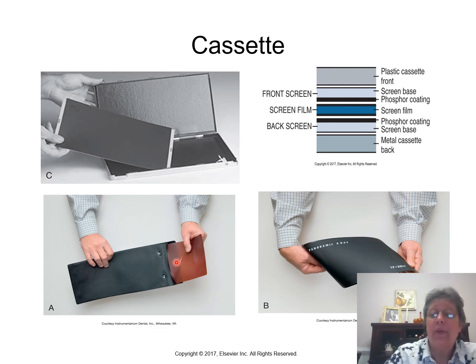Otherwise, you may have it in front, and then the film is not going to be exposed, because the radiation may hit the film first, and there's nothing to energize those screens to emit the light to produce the latent image.